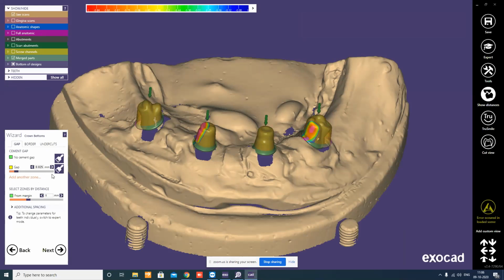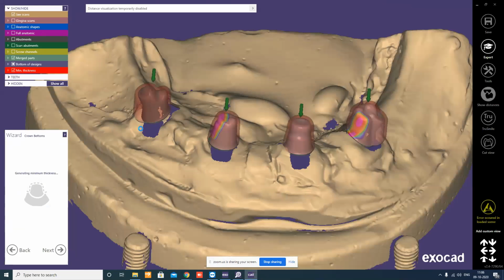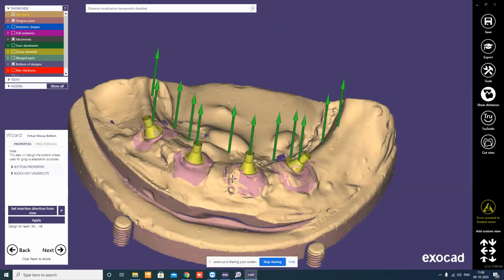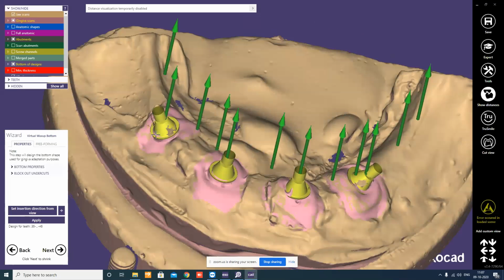We increase the cement space because the undercut is there. You can see this, doctor, it is a nasty undercut, so it is leaving the margin open. I'm worried about that, but let's see how to address it. Maybe in the abutment, we can fill up some material and increase the diameter of the collar. I hope I can explain properly.